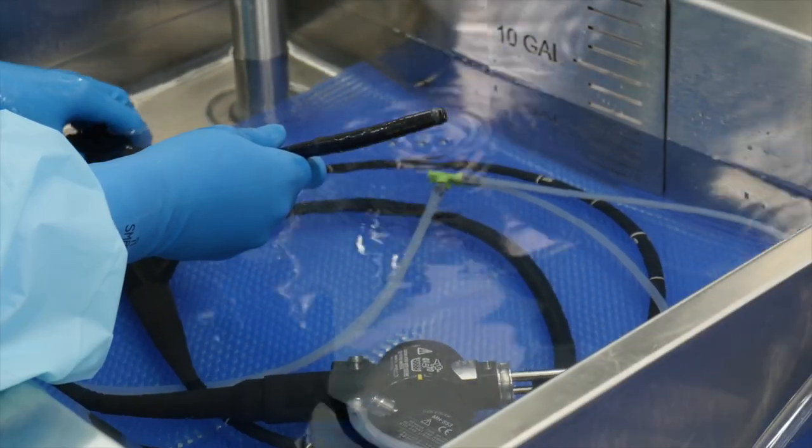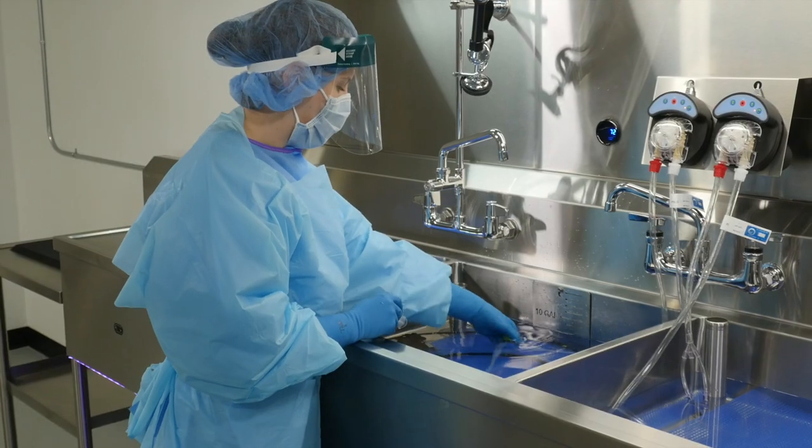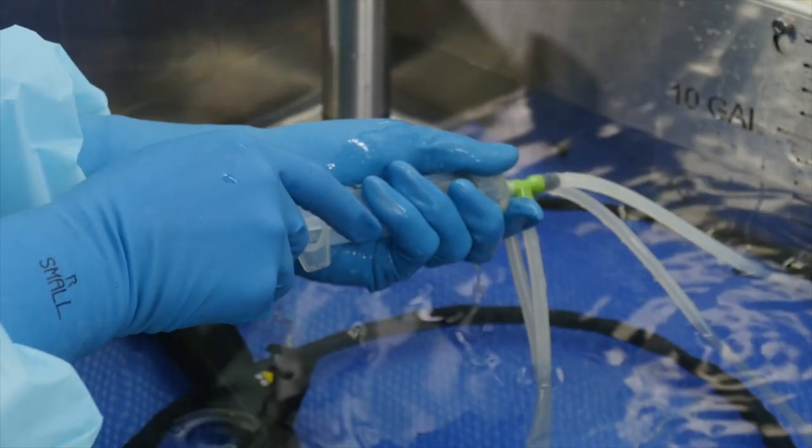Flexible and rigid endoscopes are inherently challenging to clean due to their complex design. Paired together with a limited inventory and a high demand for turnover, there is an even greater need for an efficient and safe method for reprocessing scopes.